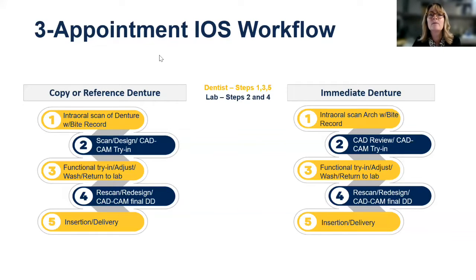Let's see here. Can you print a fibered look to the pink resin base? I'm going to answer that live. I believe there are 5 different shades within the realm of the Dentsply Lucitone Print options, and I believe one of them is fibered. Great question.